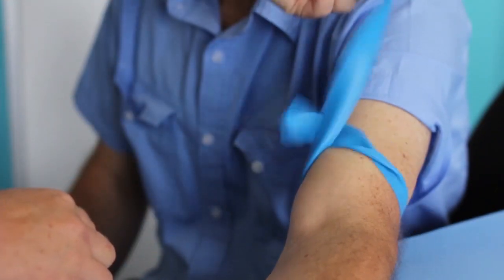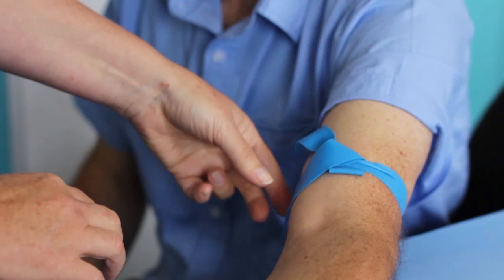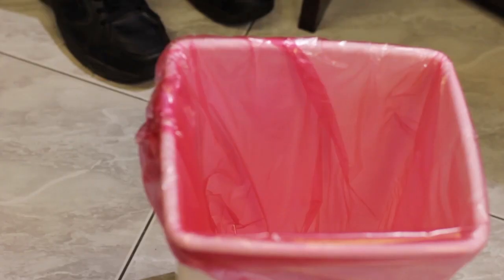If a tourniquet is used for preliminary vein selection for phlebotomy, do not leave the tourniquet on for more than one minute. Discard the tourniquet appropriately after use on one patient.